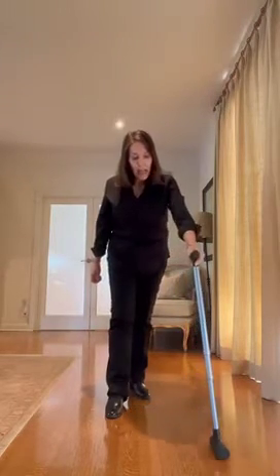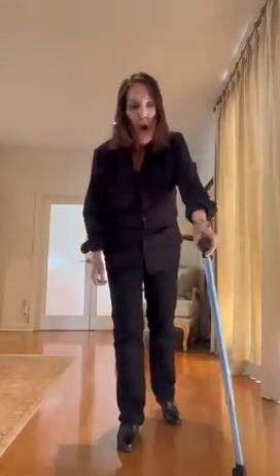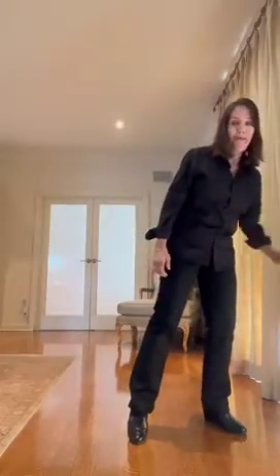The third foot cane is not a traditional cane. It needs to be adjusted and used differently. If you try using it like a traditional cane and moving it out in front of you, or if you don't adjust it high enough, you won't feel stable or balanced or be able to get the benefit.